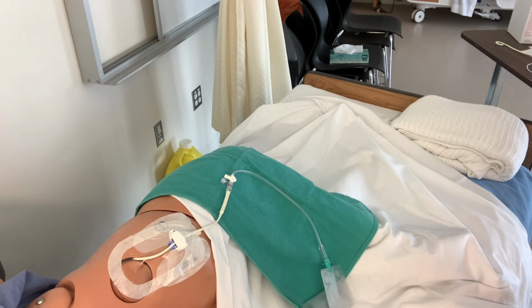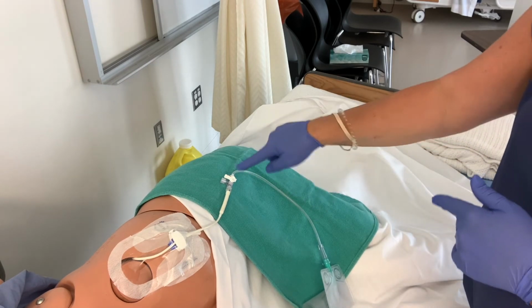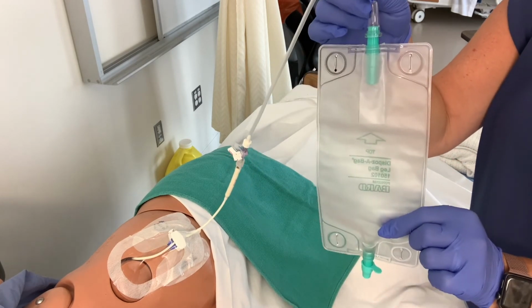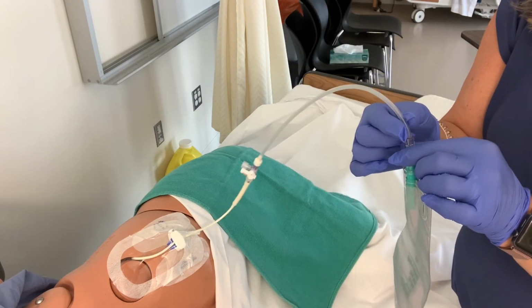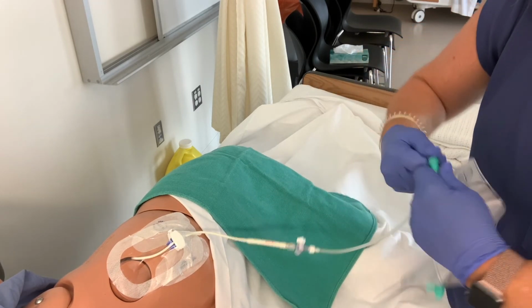And then we're going to do everything essentially the same, but we're just going to remove this portion. I'll lift it up a little closer where you can see it, but this is the bag and this is the connecting tubing. So it comes together in a package, but it is not put together. So it looks like this.